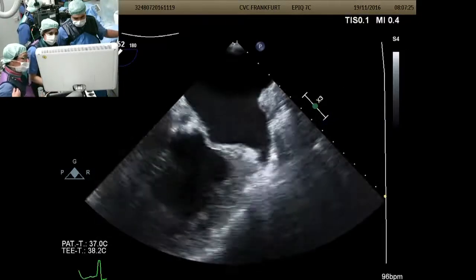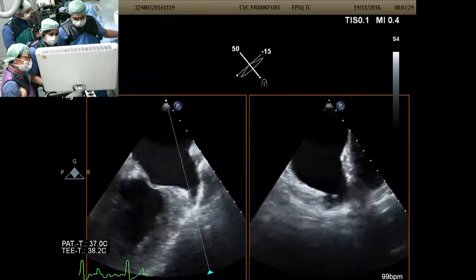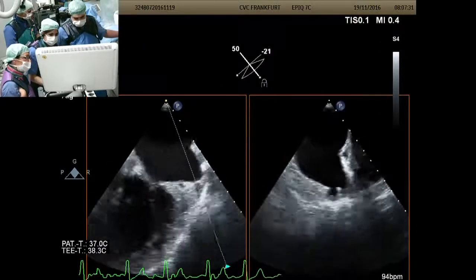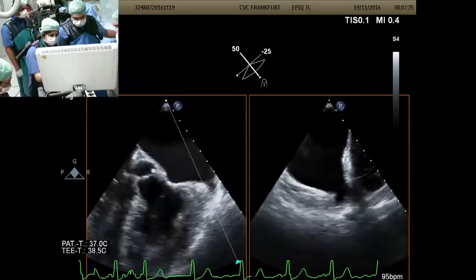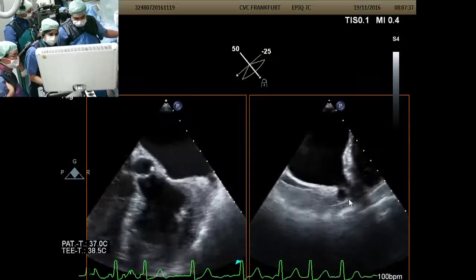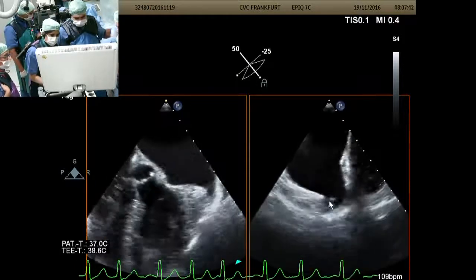And then let's just look at the appendage now in detail again. I'm just going to explain because this anatomy is looking very interesting. So you can see here, in fact, you get a glimpse of it as we move around on the right window. So this is the orthogonal view. You can see two very short lobes.